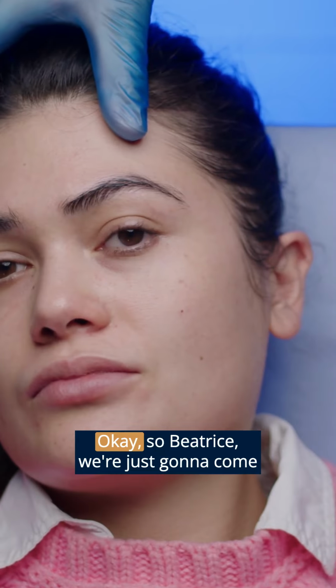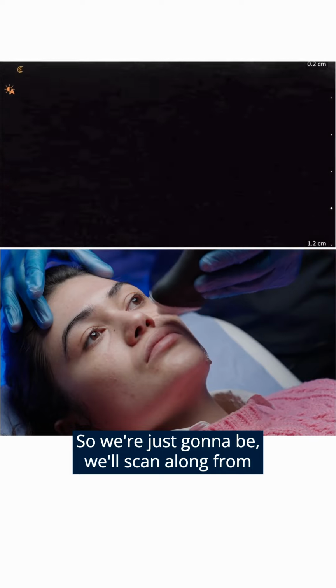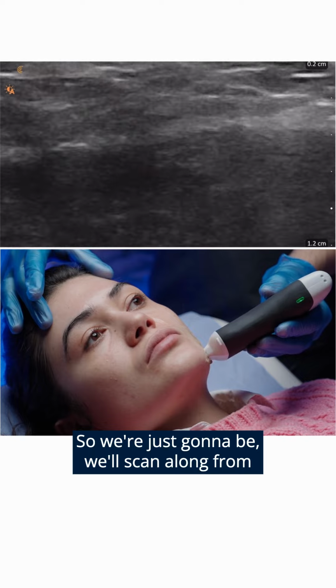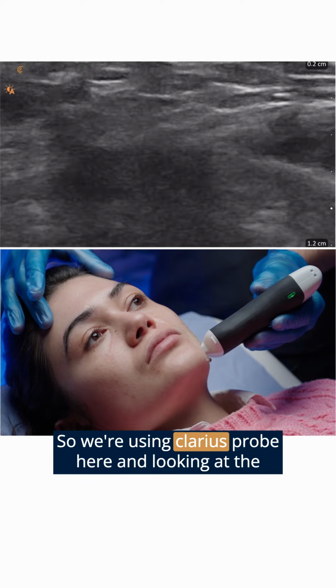Right, perfect. Okay, so Beatrice, we're just going to come into the scanner. So I've just got some jelly. If I just get your chin up a little bit. Perfect. So we're just going to be scanning. We'll scan along from the jawline, finding the facial artery, and I'm just going to discuss the planes. So we're using the Clarius probe here.